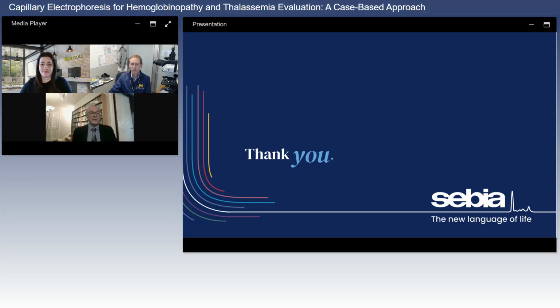I think Mark could answer this just as readily as I, but in general, alpha thalassemia is going to suppress the expression of a lower expressing beta variant. So if you have a beta variant that expresses slightly less than hemoglobin A in the trait form, when you add that alpha thalassemia impact on it, generally the lower expressing one is going to go further down. So hemoglobin S, which routinely expresses a little less than hemoglobin A, that gap is going to grow and the S is going to go down. Is that your experience as well, Mark?